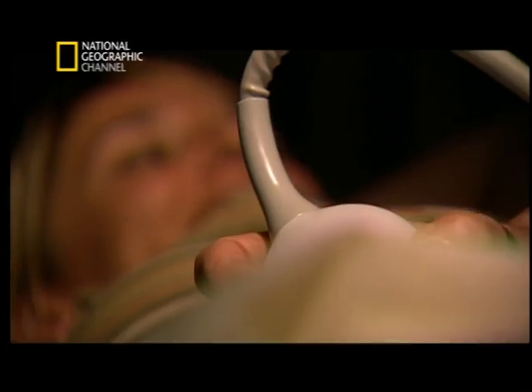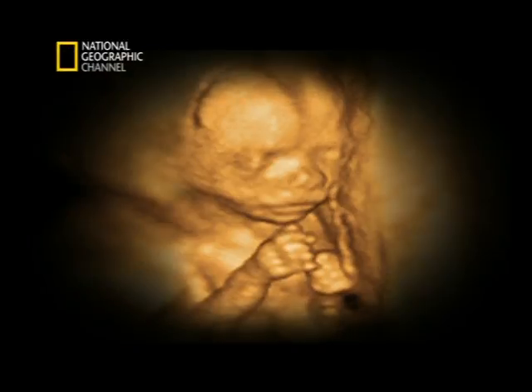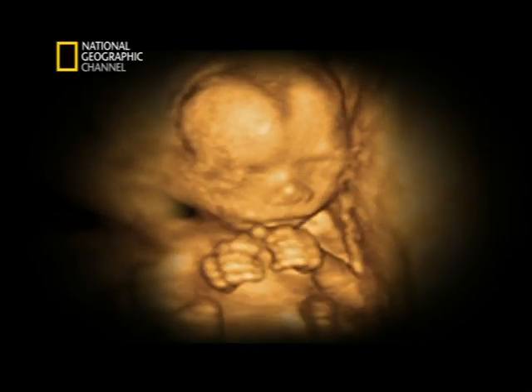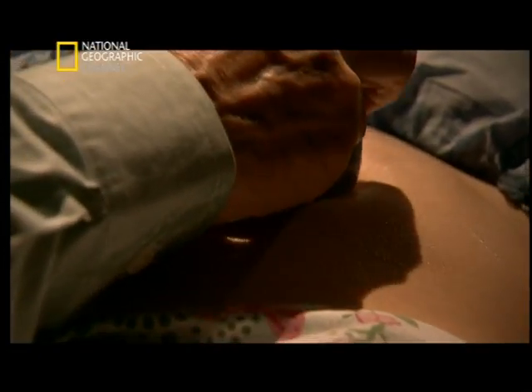Most mothers will have a more detailed second scan around now, which will survey the anatomy of the fetus and measure the rate of growth since the last scan. Wow, so now baby is... These scans are performed for medical reasons only and help to predict possible complications. 4D scans are especially good for diagnosing a cleft palate.